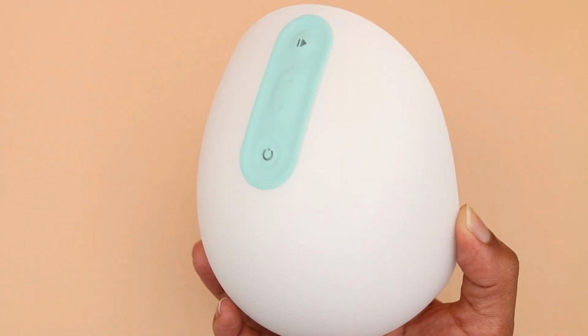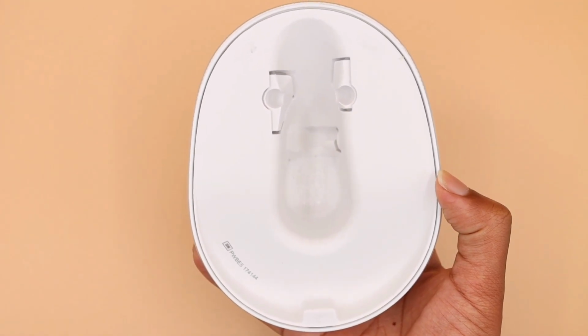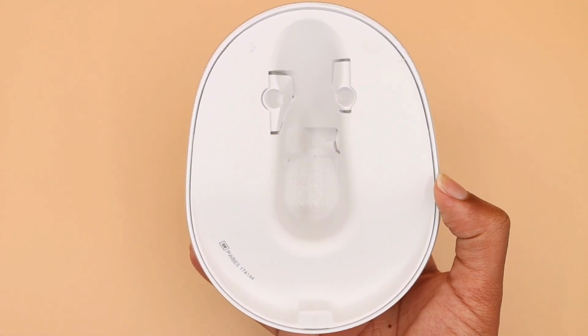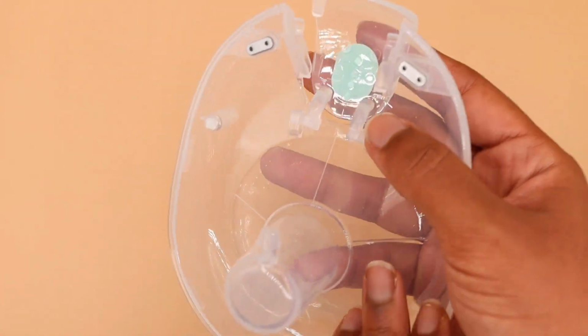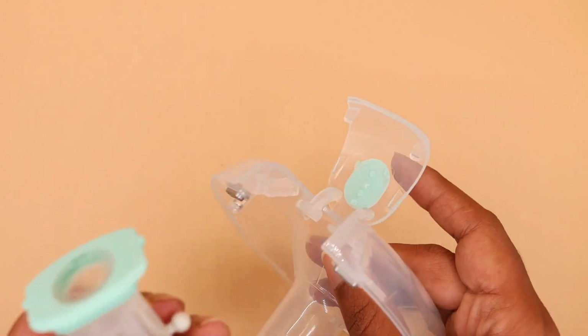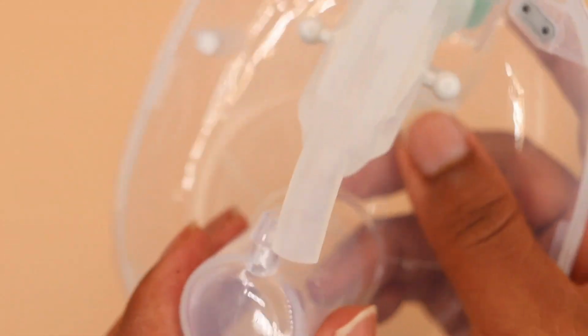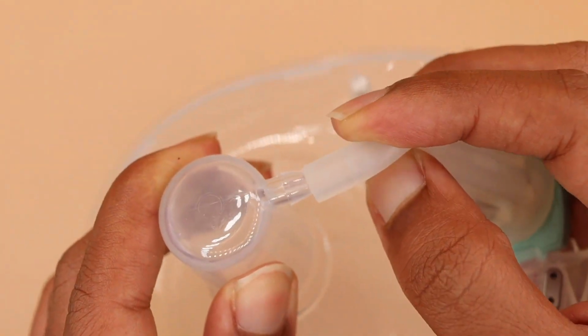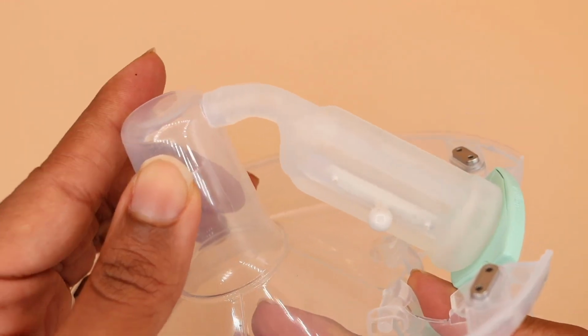So the assembly for the breast pump is really easy. You just flip the pump on its back. There is a place where you put your flange. First you open up the flange and you attach the flex tube to the flange. It's very easy to snap the flex tube into the flange. Of course, you just make sure you snap it in, attach it to the back. This is how the milk will flow into the bag, okay?